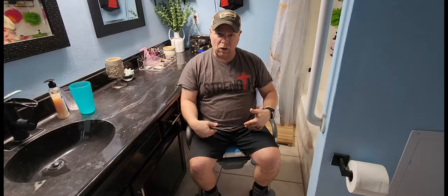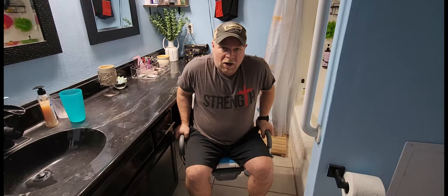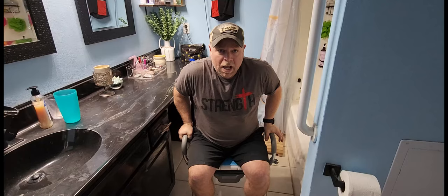I'm 5'4" and 200 pounds, and I've got this set on the lowest setting. For me, this is where I would leave it — it's comfortable, my feet are flat on the floor, I'm stable, and I'm able to use the arms to push up. You can put a lot of force on those arms to help raise yourself up.